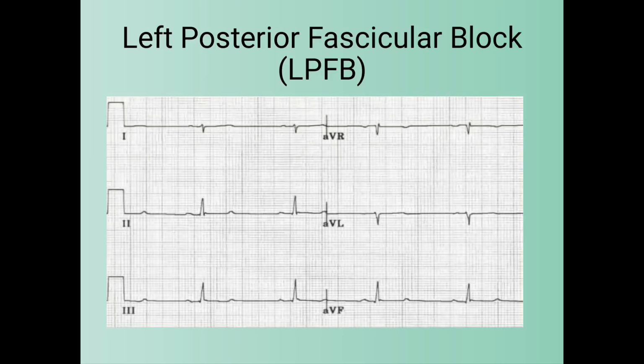Hi friends, in this video of ECG basics, today I will talk about left posterior fascicular block.